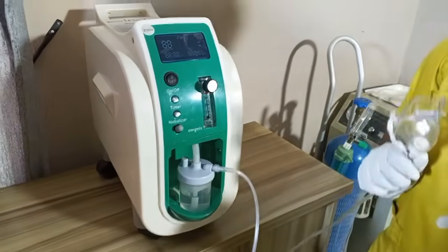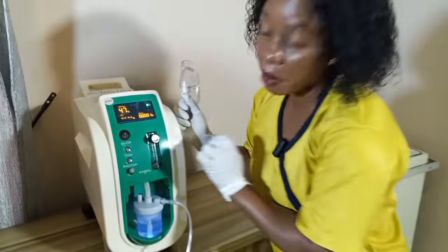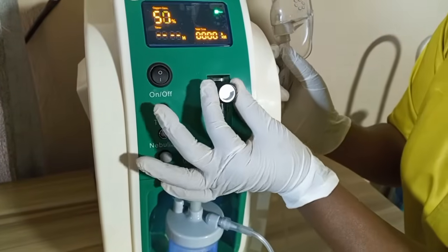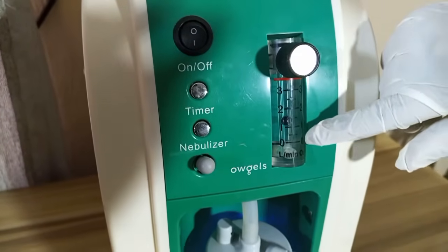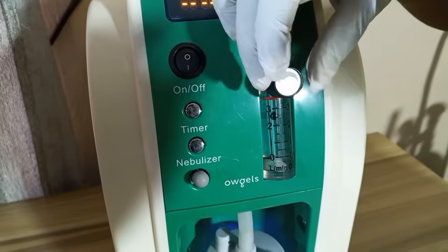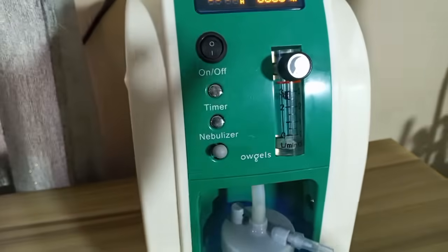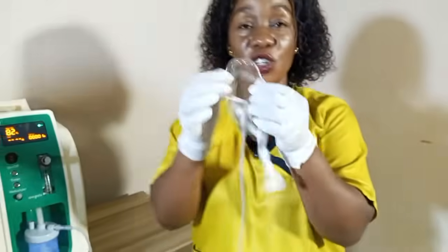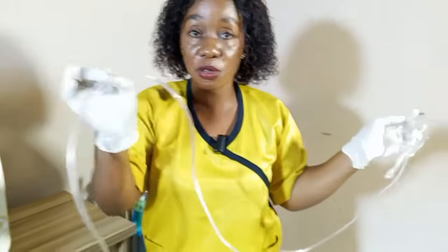The next thing is to turn on the oxygen concentrator. If you are using this type, you have to wait for a while before it comes on. The prescription says 3 liters per minute, so I regulate the oxygen by turning it clockwise. You can see this ball inside — push the ball to 3, that is 3 liters per minute. Always observe the tubing for any leakages or perforations so that the oxygen will not be escaping.